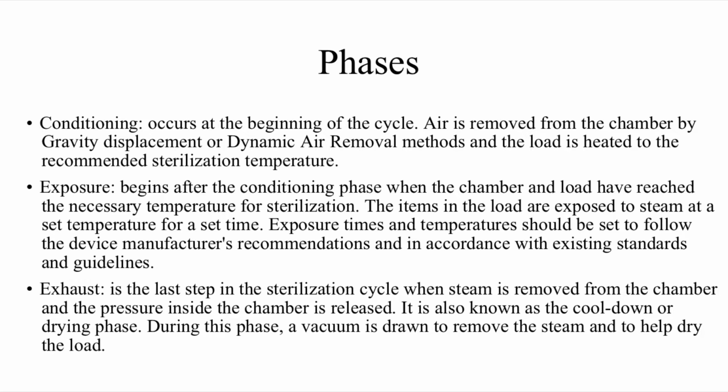Exposure begins after the conditioning phase, when the chamber and the load have reached the necessary temperature for sterilization. The items in the load are exposed to the steam at a set temperature for a set time. Exposure times and temperatures should be set following the device manufacturer's recommendation, in accordance with existing standards and guidelines.